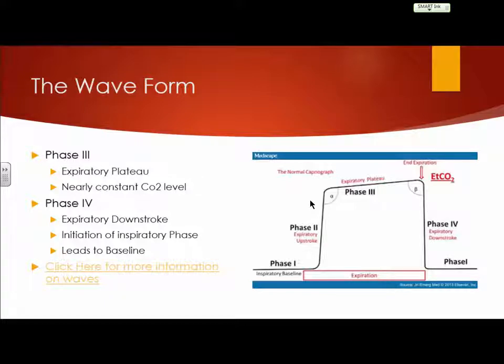So the drop-off of the expiratory phase, is that the equal atmospheric pressure, then you hit that part right there? At the point? Yes. And so once it starts going down, you're starting to inspire then, right? Mm-hmm. Then it plateaus at the bottom when you stop the inspiration, right? Right. So when it peaks back up. Right. All right.